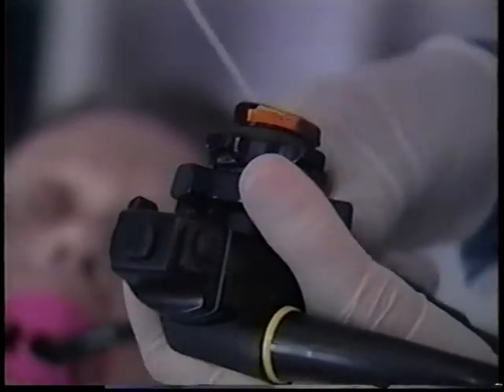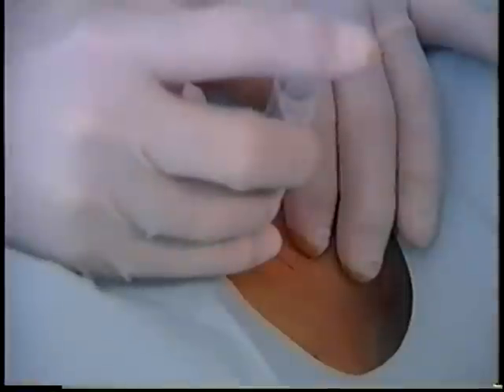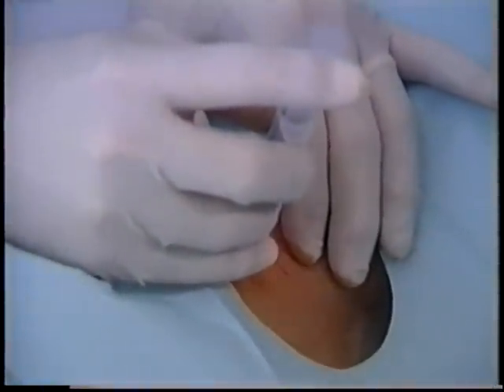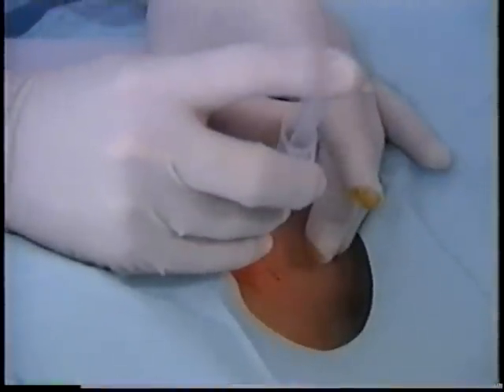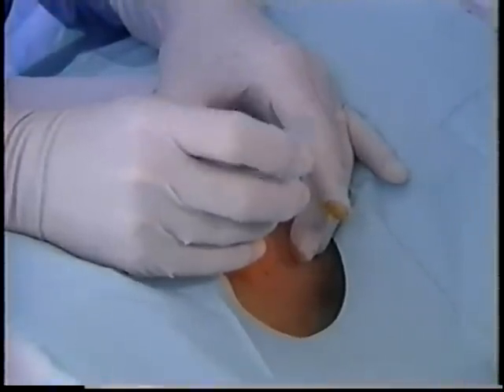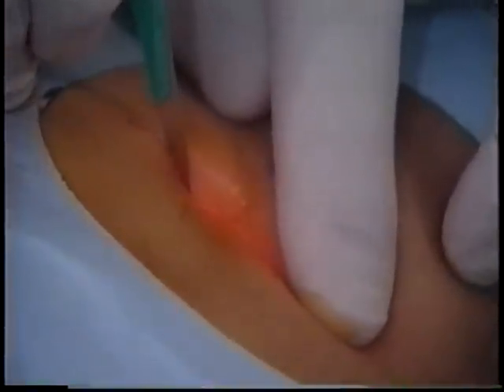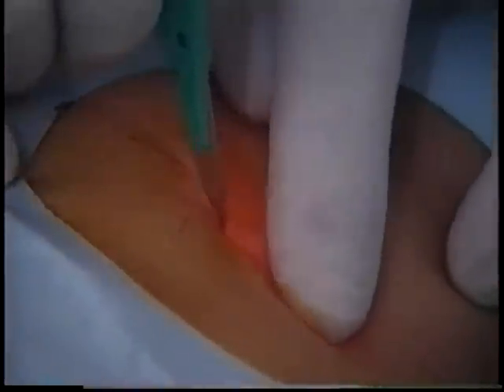A snare is advanced through the biopsy channel of the endoscope and positioned at the proposed entry site. After a sterile prep of the site is completed, local anesthesia is administered. The needle is then advanced through the gastric wall while pulling back slightly on the syringe plunger. Safe site selection is confirmed when endoscopic visualization of needle tip entry into the stomach corresponds with air entry into the syringe. A 1 to 1.5 centimeter incision is made at the entry site. This incision must be sized to accommodate the diameter of the PEG tube that is to be inserted.